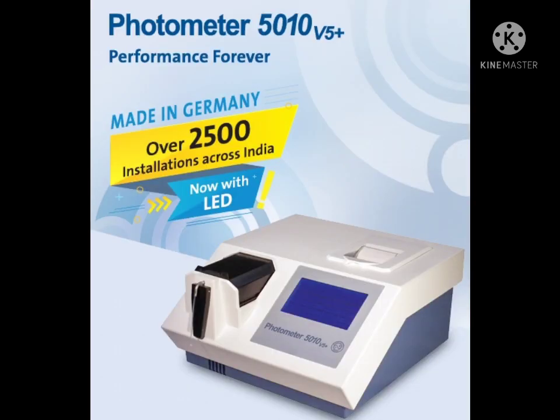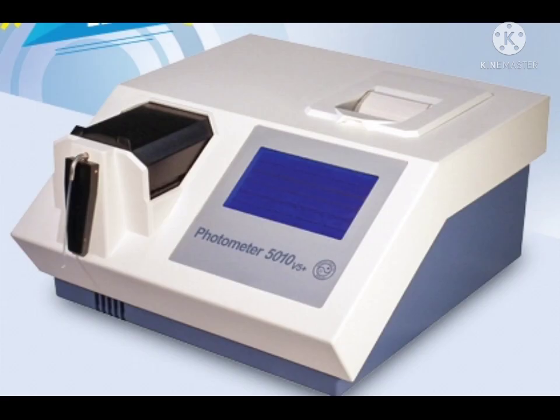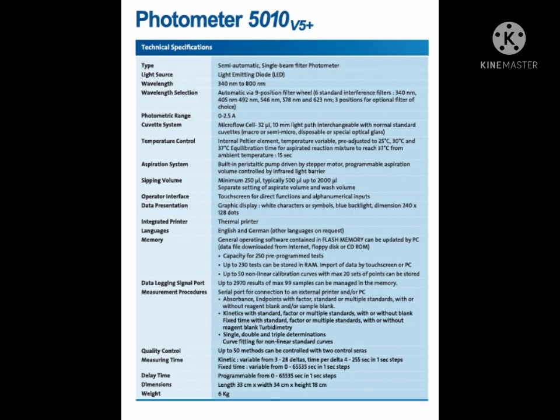Photometer 5010V5 plus, semi-automatic biochemistry analyzer by DIASYS. Light source of this instrument is LED light source. These features were also available. These features you also can find in Biosystem BDS 350.